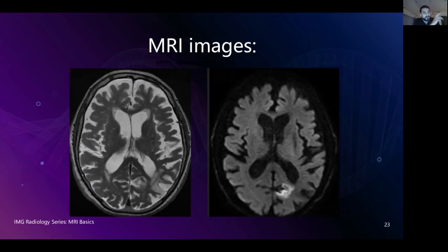What essentially enhances signal and what has a lower signal? So is the fluid in the ventricular areas higher signal or lower signal in comparison to the surrounding brain tissue? Yeah, hyperintense signals. Great, fantastic. So you can see at the bottom, towards the occipital area on the left side of the patient, there's a small abnormality we're talking about here, essentially.